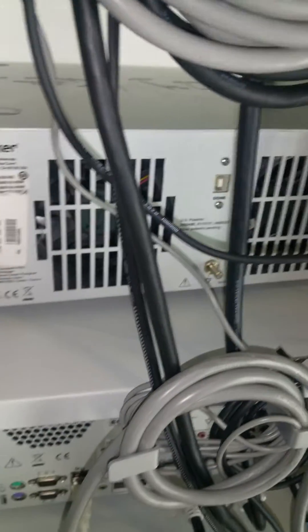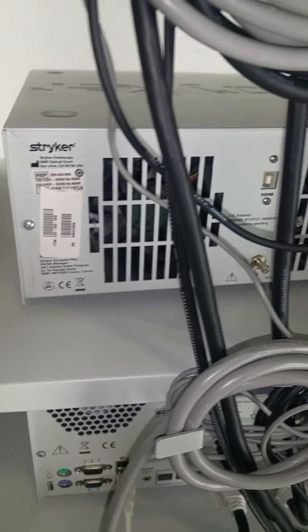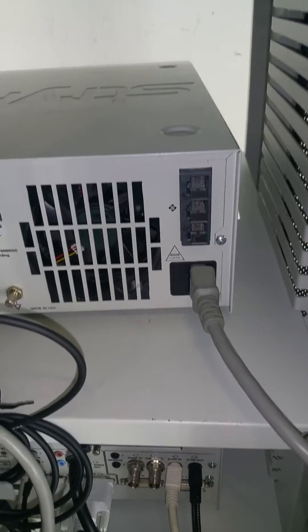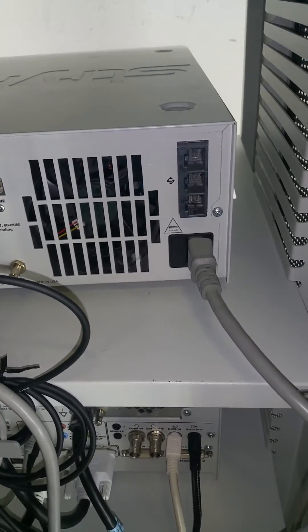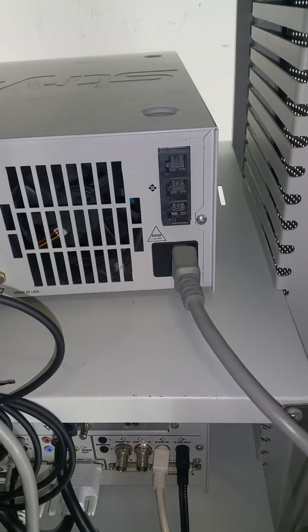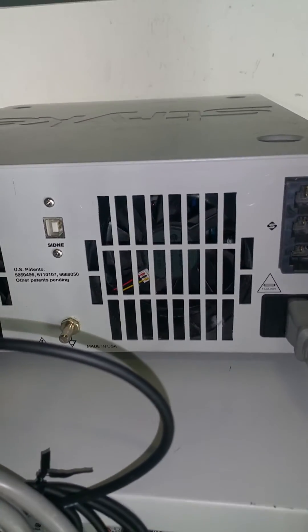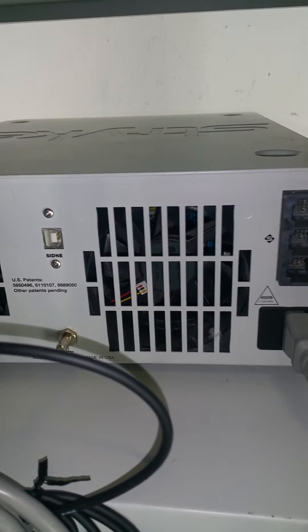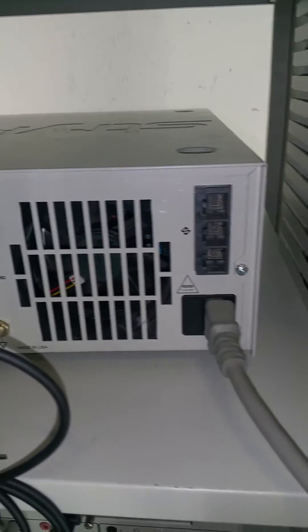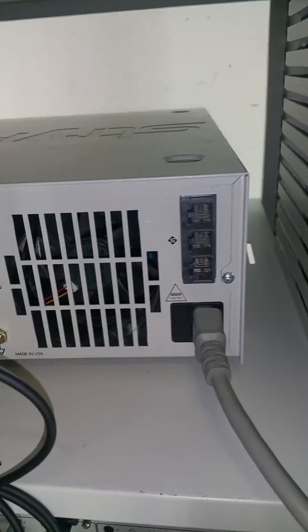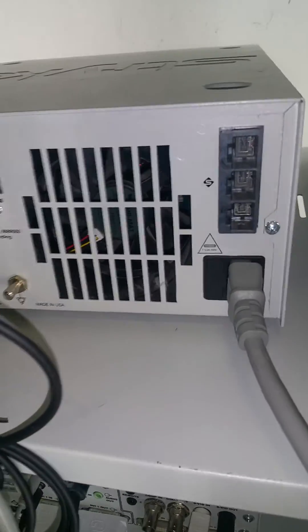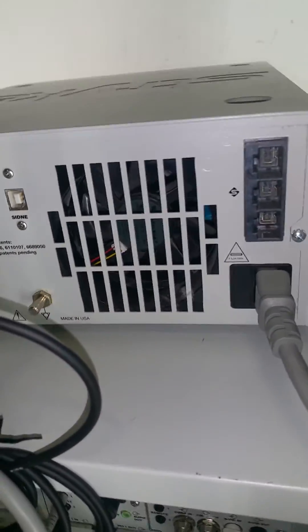you have the X8000 light source. The only thing that I have hooked up with this cablewise is just a power cord. You can, it is capable to hook up to Sydney, but that's not the setup that you guys have.